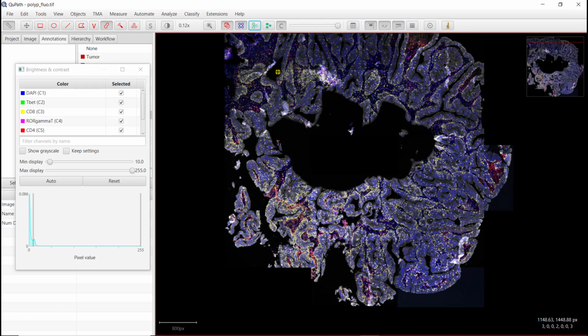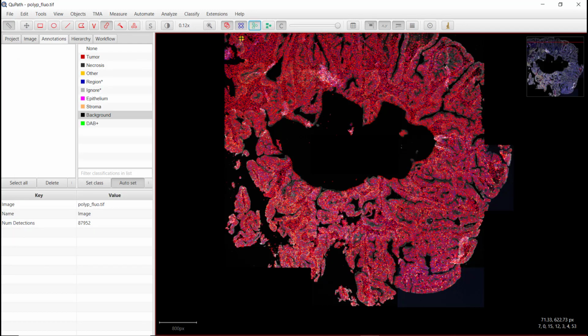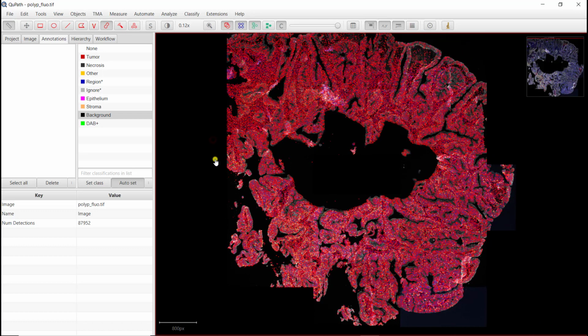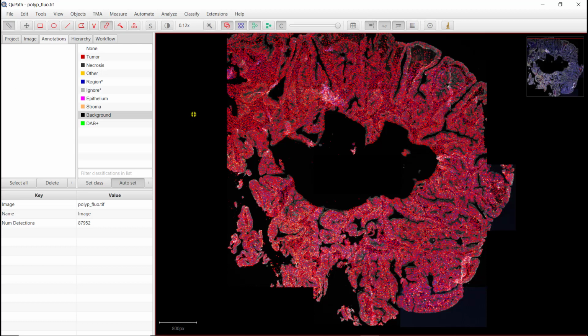identify your positive cells. So to do this in QuPath, you have a nice feature which is duplication of all your channels. So you duplicate your image for all your channels. When you do that, just make sure that you actually save your image, so that, for example, if you did the nuclei segmentation, you have your nuclei, but if you don't save the image when you duplicate it, you won't have the nuclei. You need to save it. I just did it with Ctrl S, or you do File Save. And now I can duplicate.